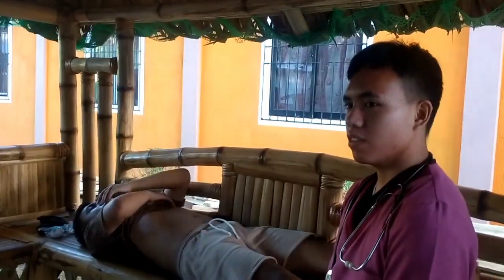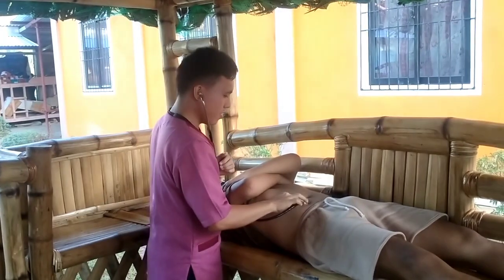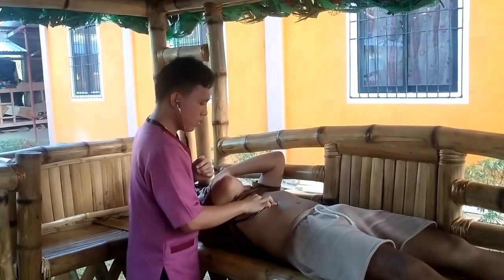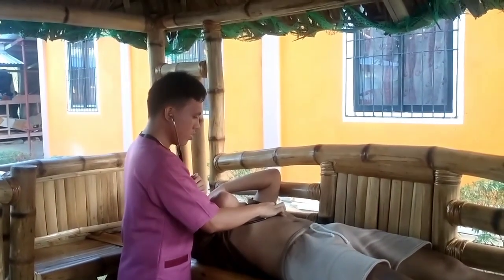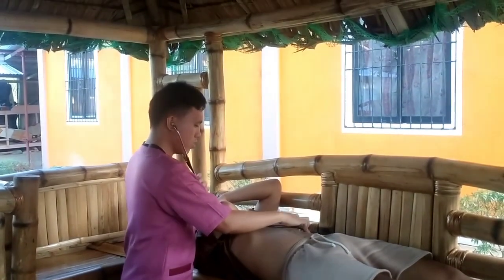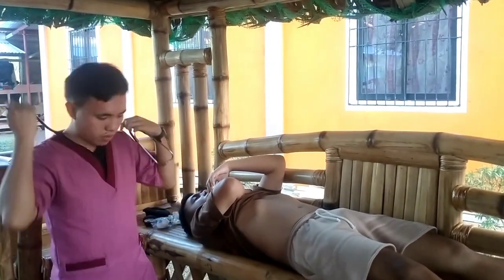For the auscultation, place the warm diaphragm of the stethoscope on each quadrant. Right lower quadrant, right upper quadrant, left upper quadrant, and left lower quadrant. Auscultate the abdomen for bowel sound and vascular sound. Listen for active bowel sounds every 5 to 20 seconds.